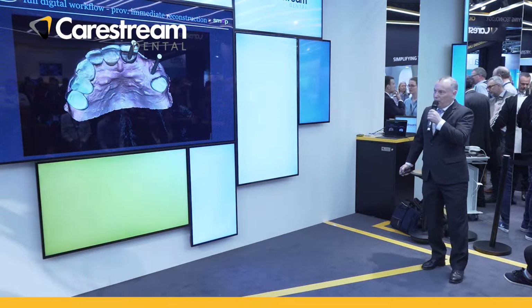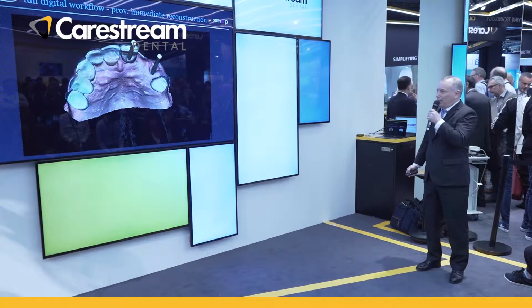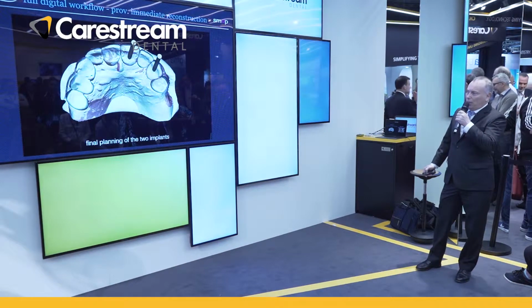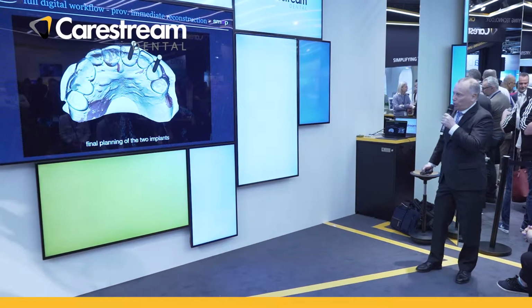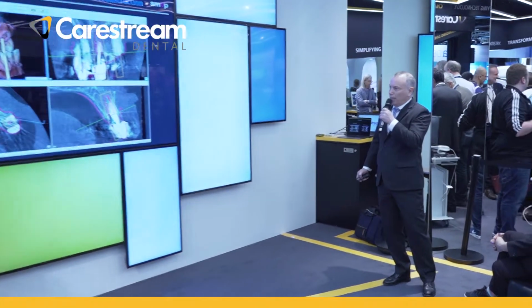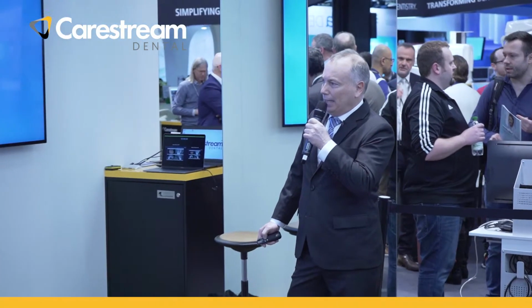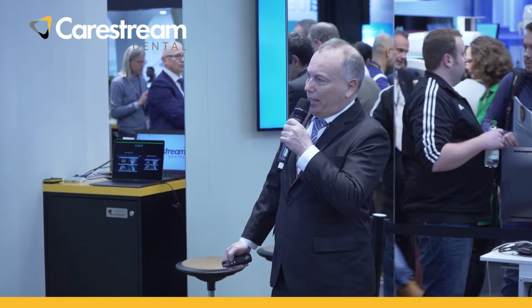You see now that the axes of the implants are behind the incisal edge, so it will be possible to do a nice screw-retained bridge with direct screws. Here we are again in the SMOP software, and this is the situation.